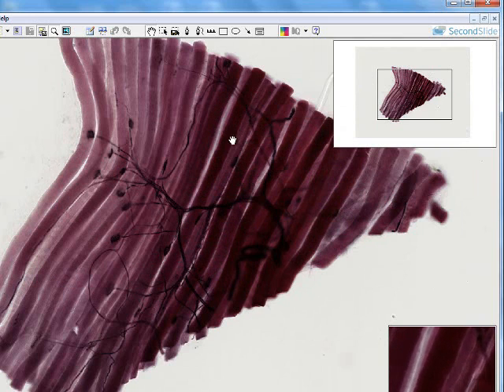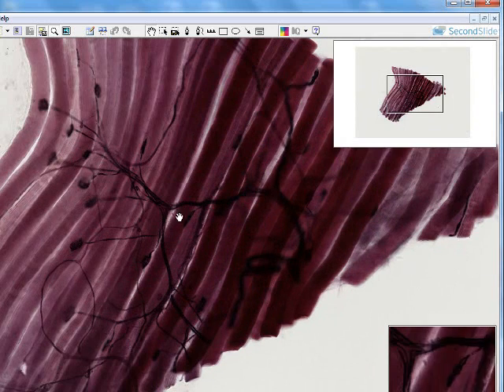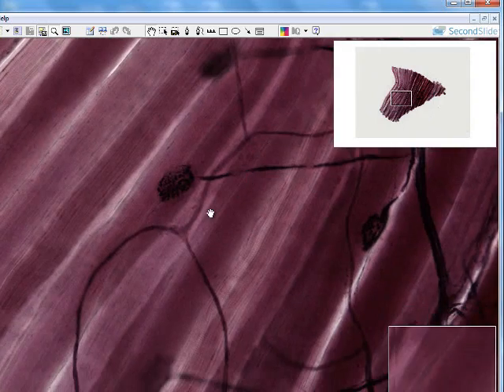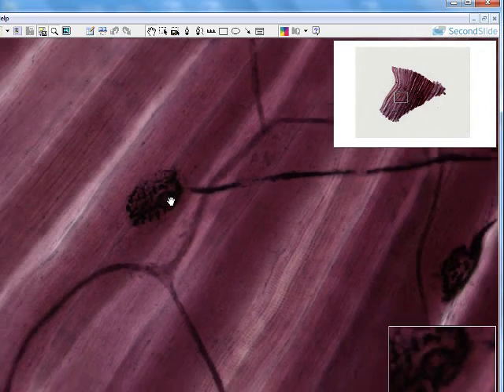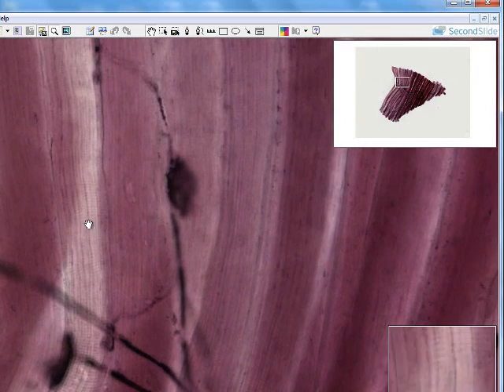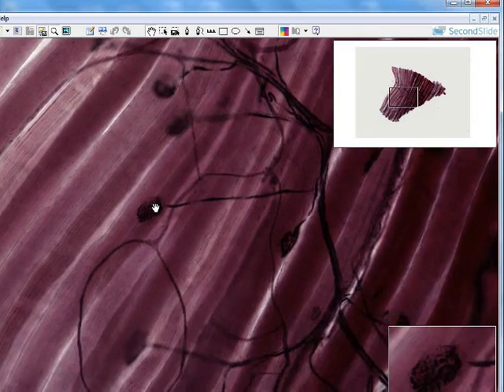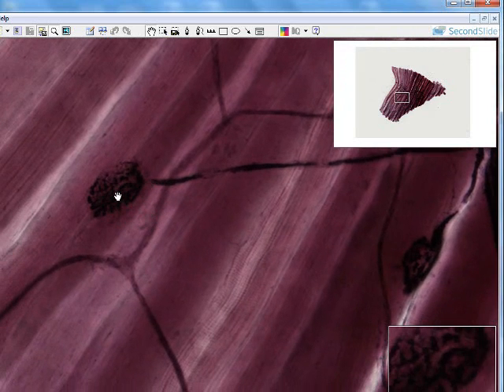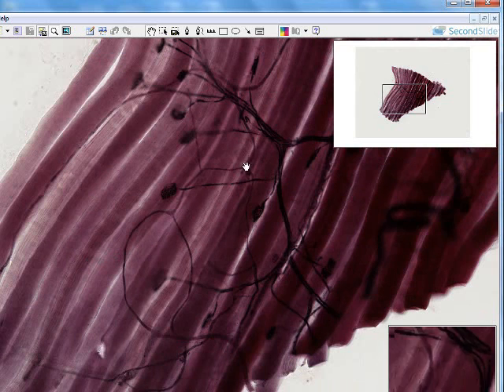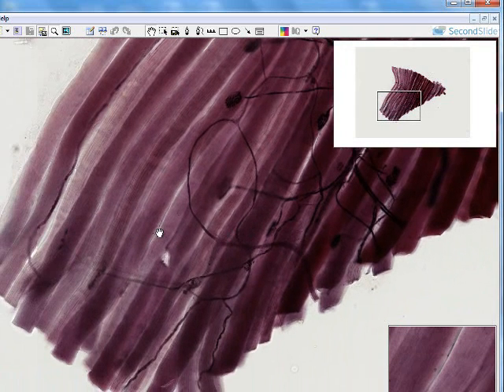So a skeletal muscle is a multinucleated cell, and you can see where one nerve would innervate more than one fiber to get the whole group of fibers collected together. These are axons, and these are motor end plates at the very end. So these are the motor end plates that we can see attached. You can see the striations of the skeletal muscle and the nuclei thereof. But I think this is the best one that we have in view, a motor end plate that we see. Again, the striations you see, motor end plate, and so one nerve would innervate more than one skeletal muscle cell.